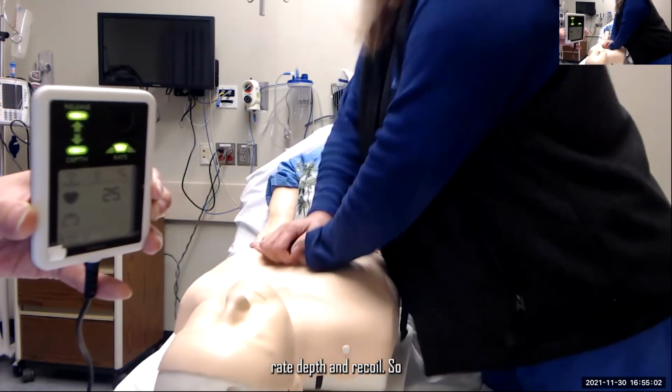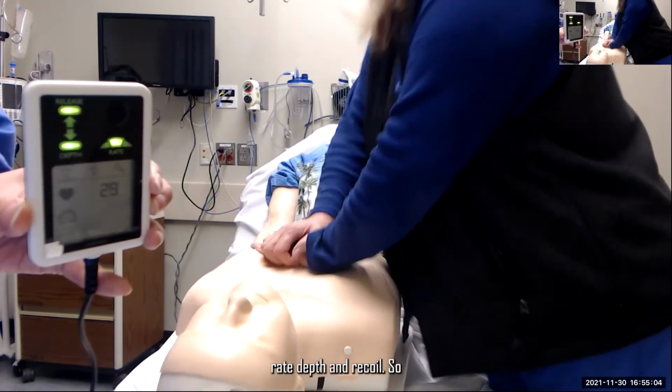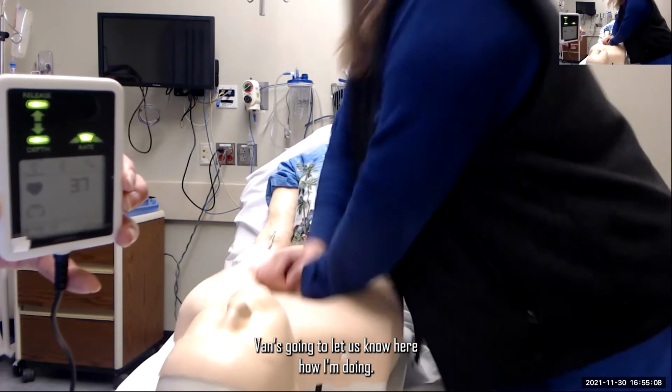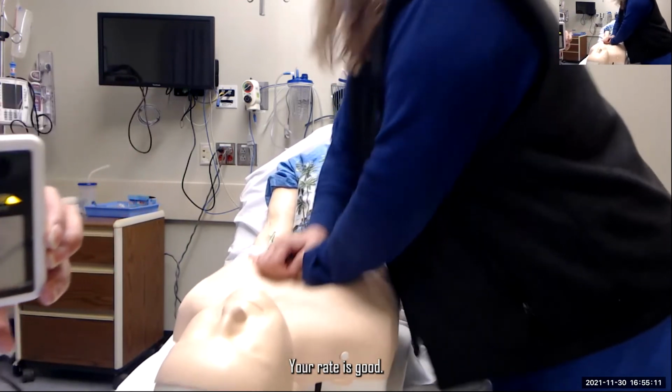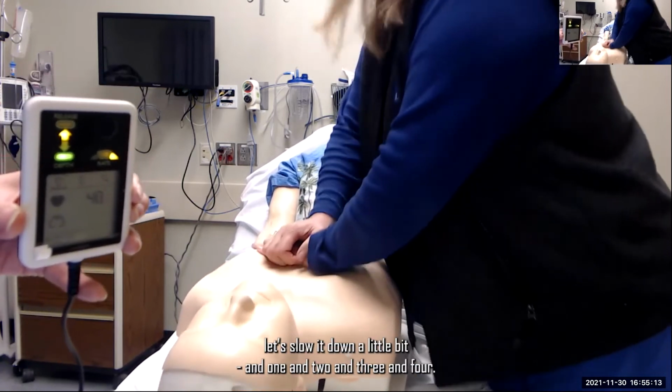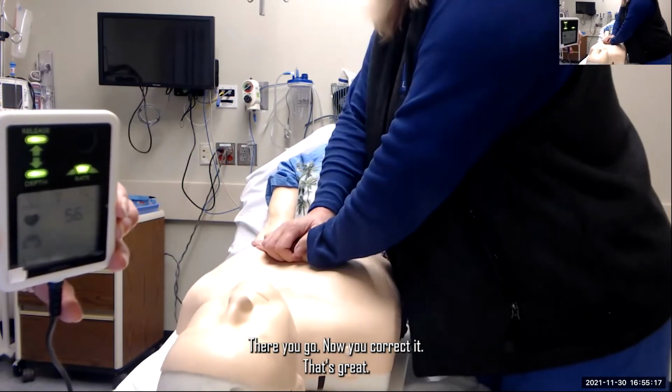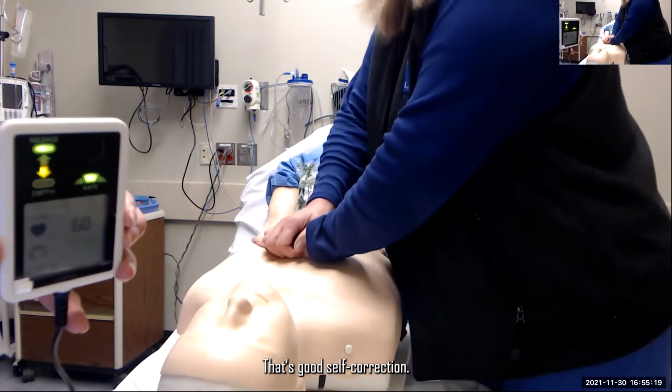So we measure rate, depth, and recoil. So Van's going to let us know here how I'm doing. Sue, you're doing great. Your rate is good. Oh, you're going a little fast. Let's slow it down a little bit. And 1 and 2 and 3 and 4. There you go. Now you corrected. That's great. That's so good self-correction.